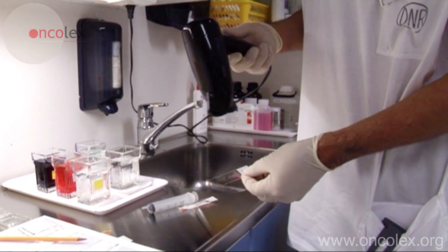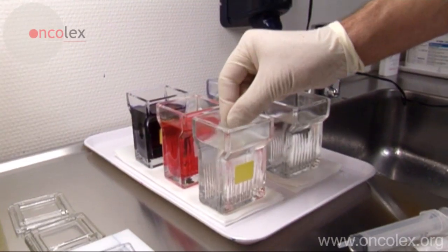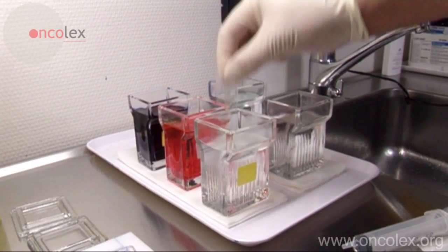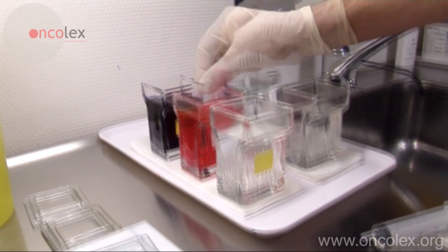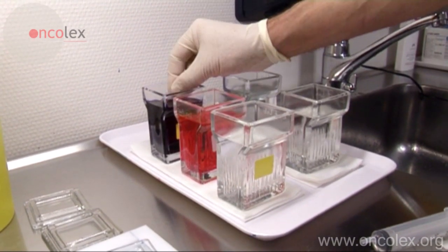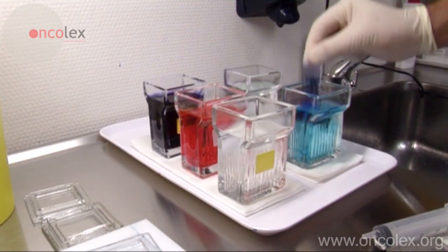The material is dried under a fan before staining. The material is first dipped 5 times in fixing fluid with methanol, then 3 times in the first staining bath and 6 times in the second staining bath, before rinsing in 2 baths of distilled water.